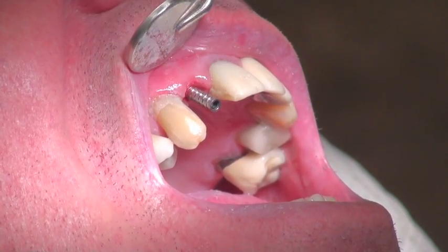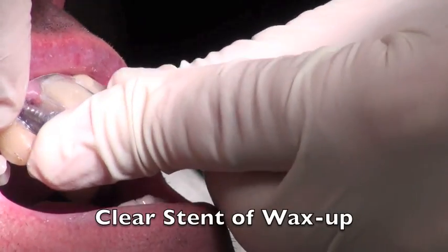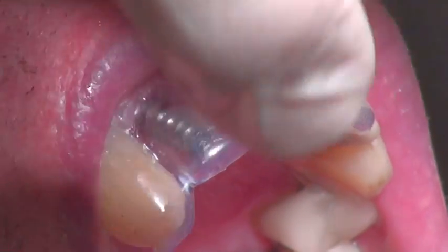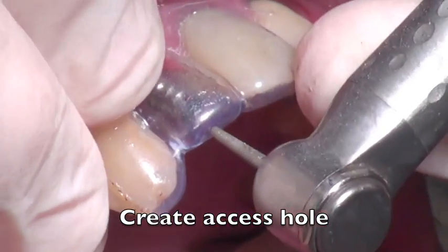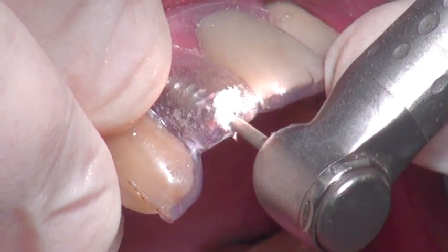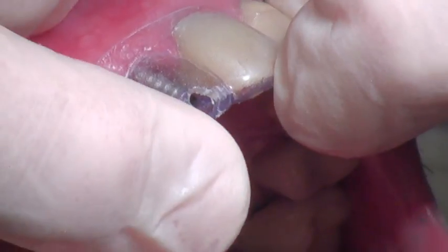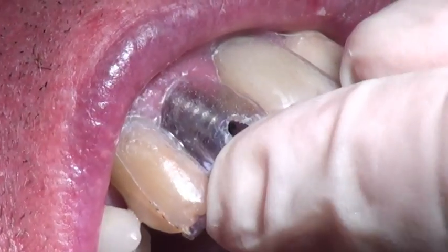One of the things we want to do is to have some type of shape to create the temporary crown. We're going to use, in this case, a clear stent of the wax-up that we originally made. This fits over top of the cylinder — sometimes the cylinder will fit through it depending on the depth of the implant. We want to make a hole for it to come through so that we can access the screw hole. Once this hole is cut and we confirm that we are able to put something in that hole, we're able to move on to the next step.